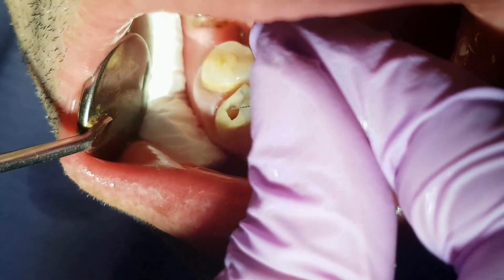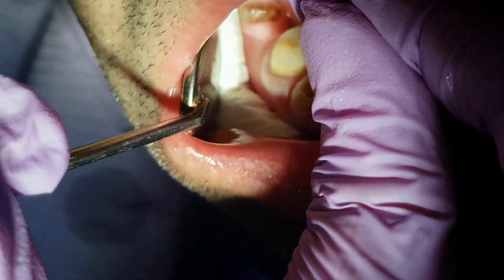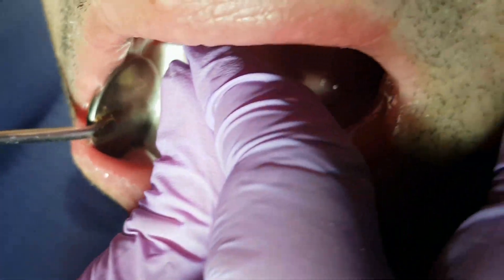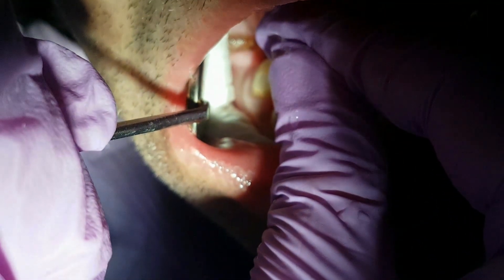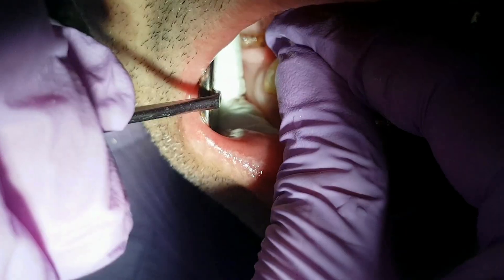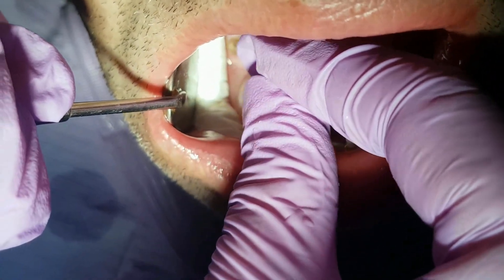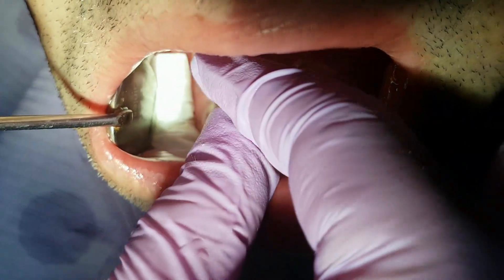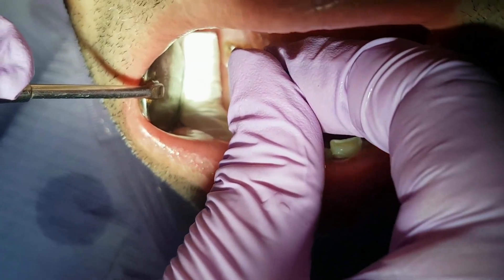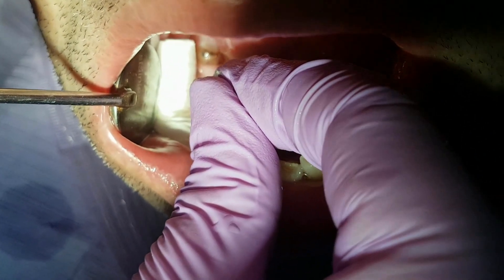We use a hand instrument to extract the nerve tissue from the root canal. You can see how this hand instrument is supposed to be used. We try to put it in the center.